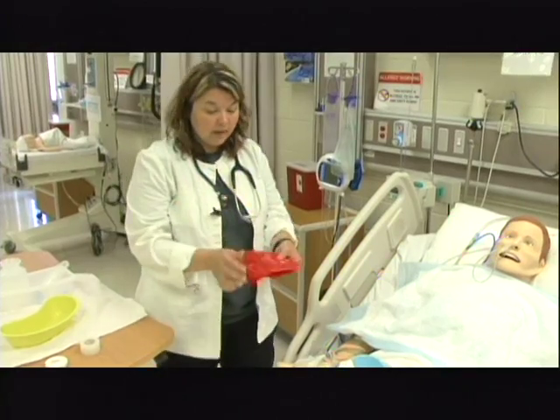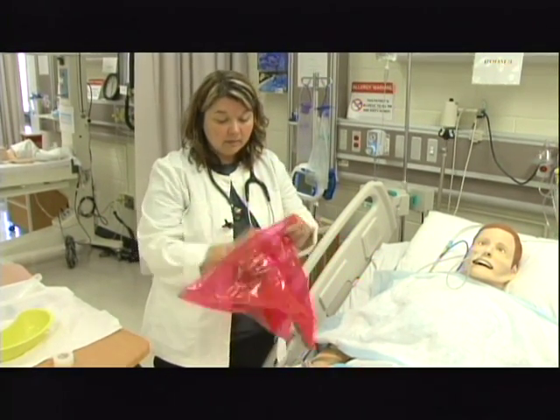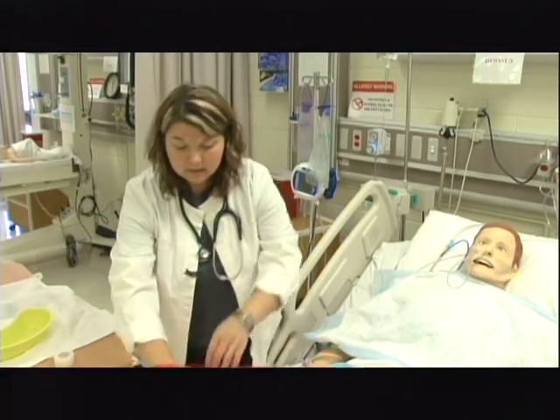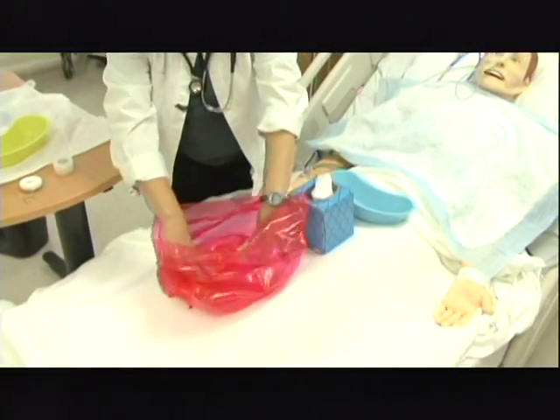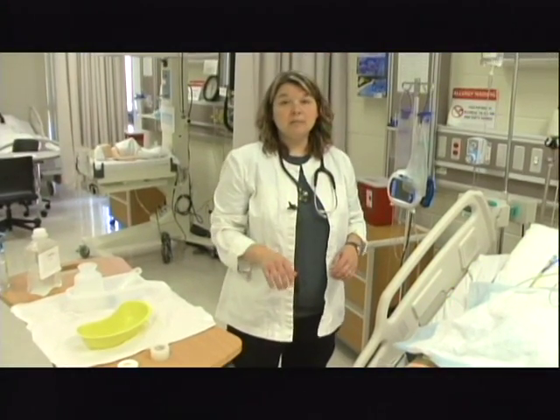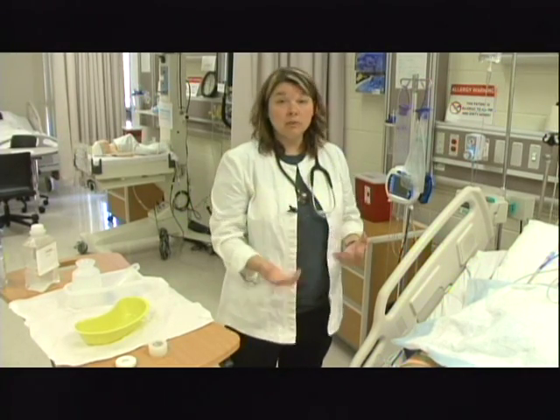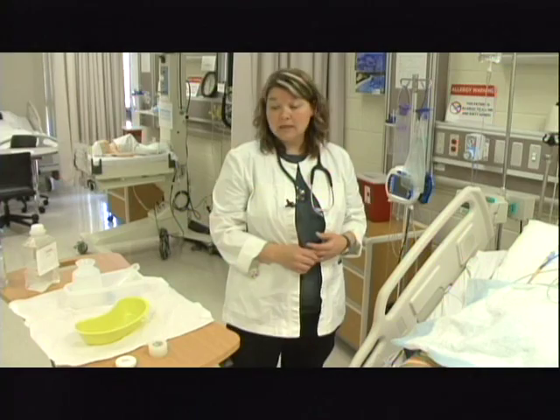When I take the tube out, I need to make sure that I've got a red bag here, or based on your facility policy, because the tube will most likely need to go into this to be thrown away. I also need to make sure that I've got the equipment here to check placement because, as I've said to you before, anytime I do anything with the tube, I need to check placement before, even if I'm pulling the tube out, just to make sure that there aren't any issues.